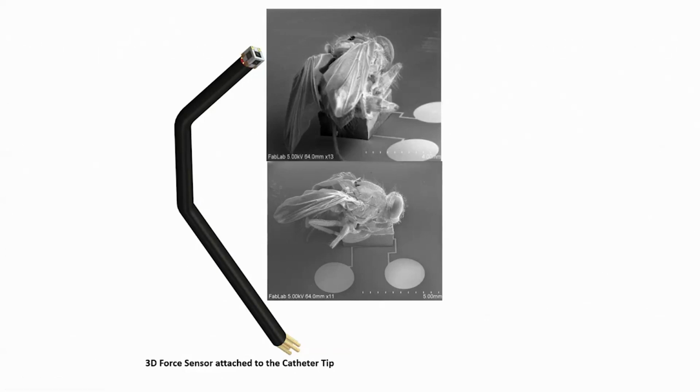The weight of a housefly is just a few milligrams. This is a dead housefly, not alive, so do not get confused with that. The housefly is dead, and we stuck it on the sensor using a silver paste. Otherwise the housefly would start flying; it is not a pet that I can ask to sit on the sensor.